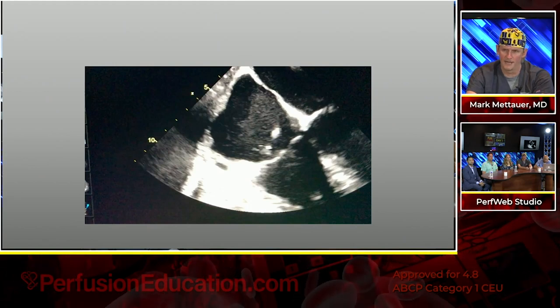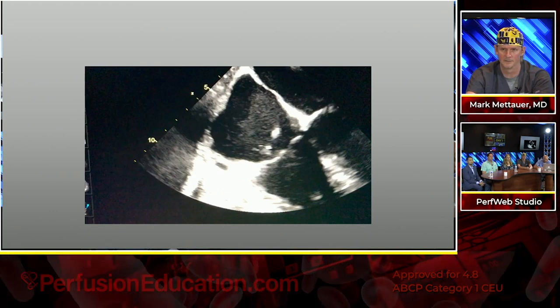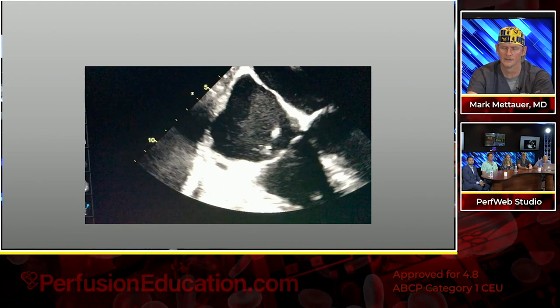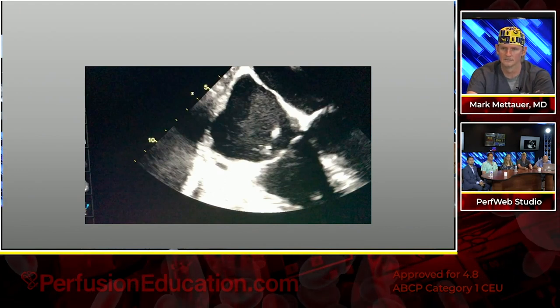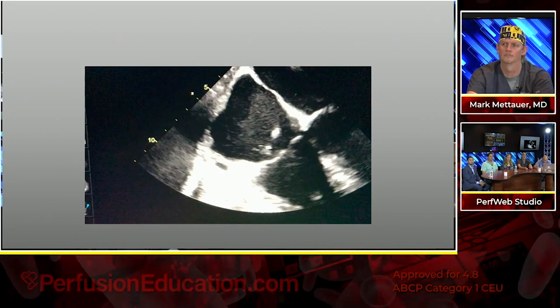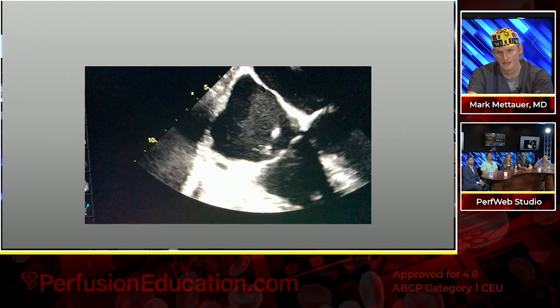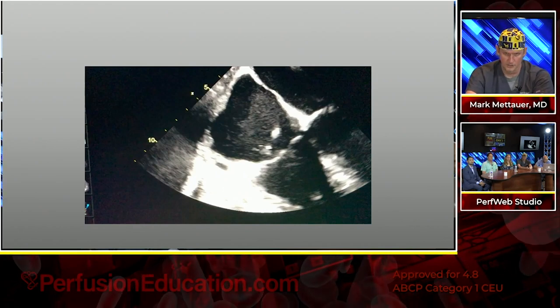We place the right femoral cannula first to return the blood, flush it, et cetera, have the pump set up, and then we start with the right side. Now the care you have to take with the right IJ is watching the wire, making sure you don't enter the heart if at all possible, which we did today. Fortunately, nothing broke off because she was so massive.